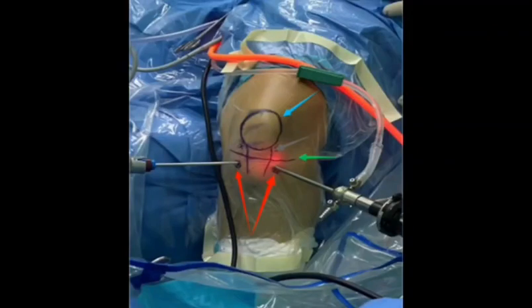The first step is to locate the portal position. The surface positions of the lateral portal to the tibial tubercle and the medial portal to the tibial tubercle are about 2 cm beneath the joint space, and approximately 1.5 cm from the edge of the patellar tendon.